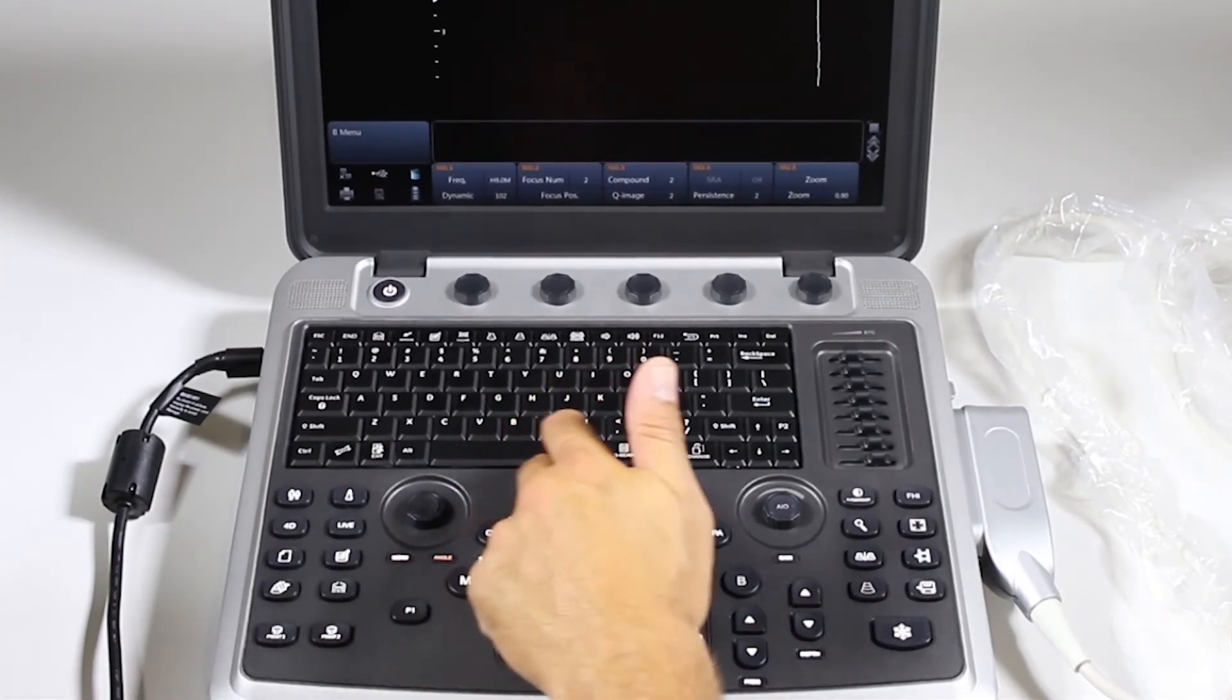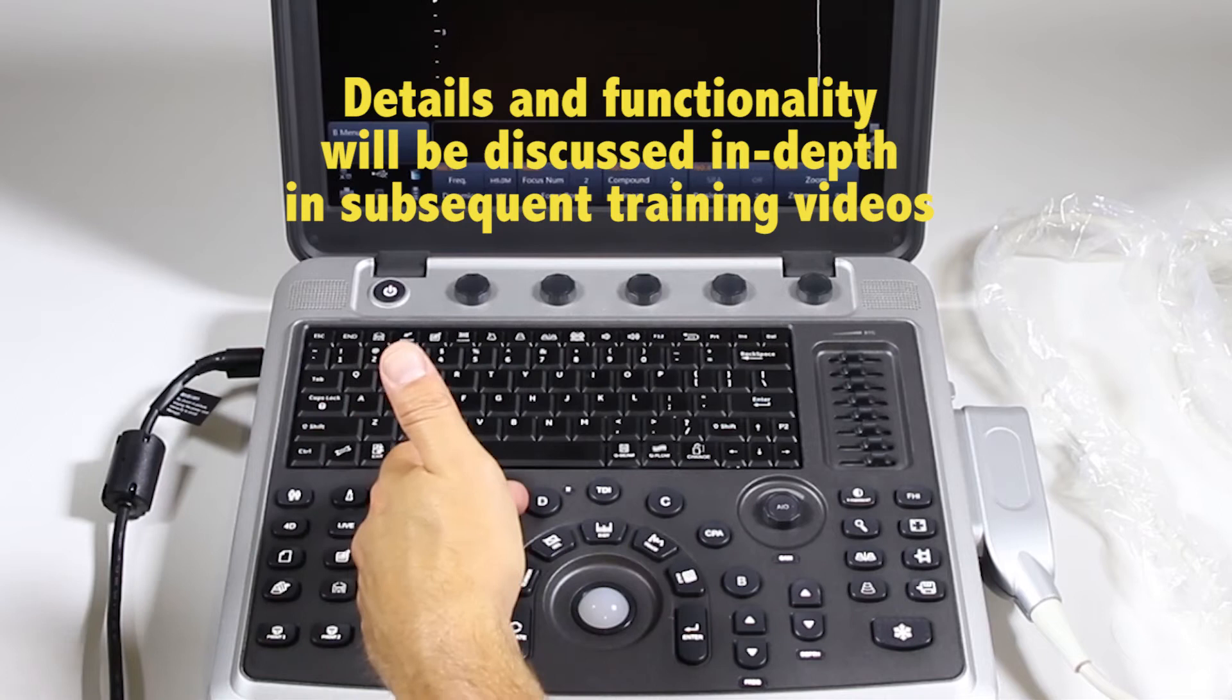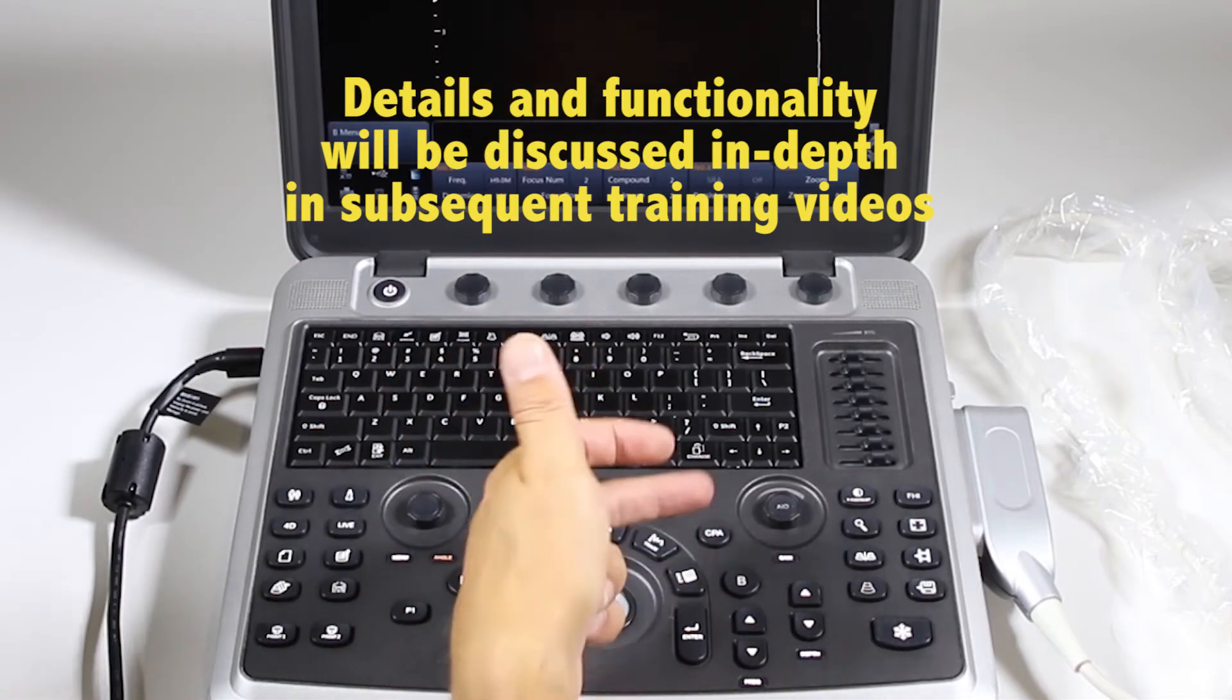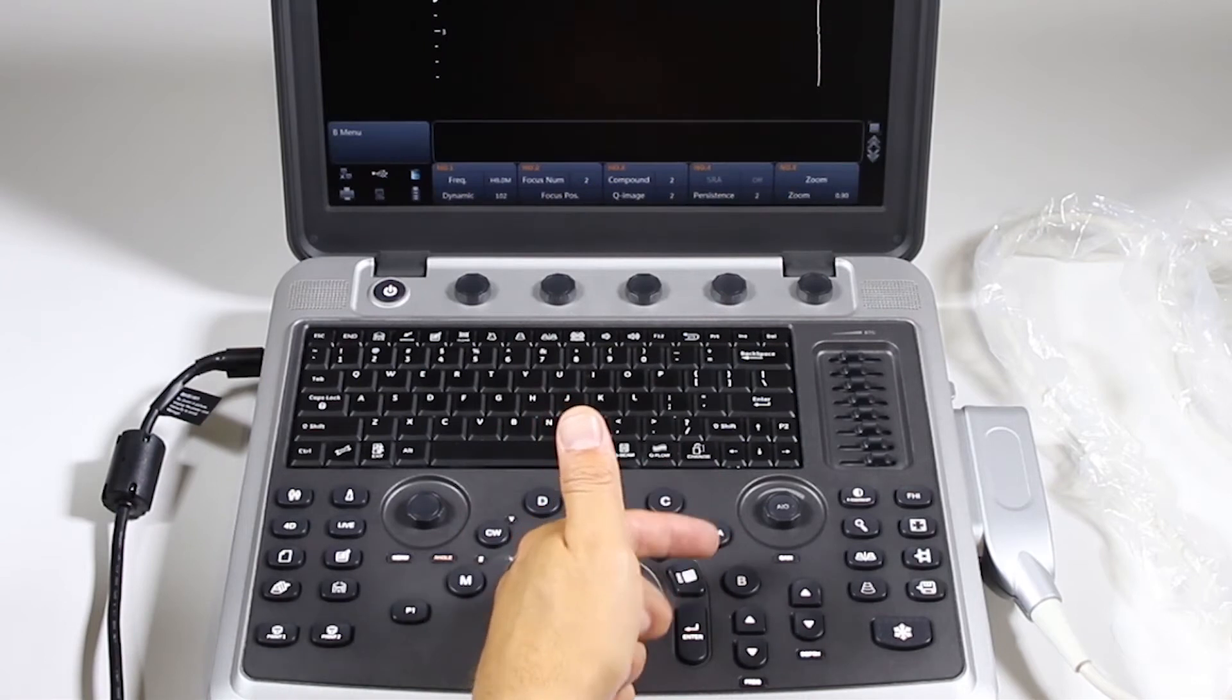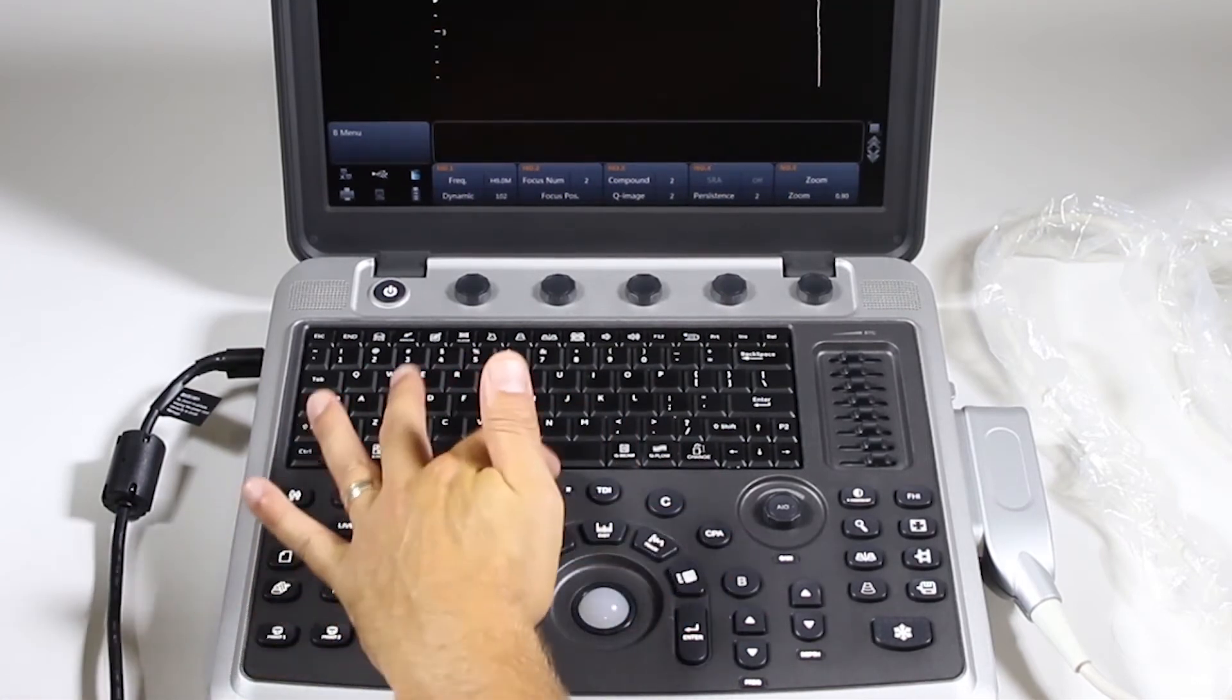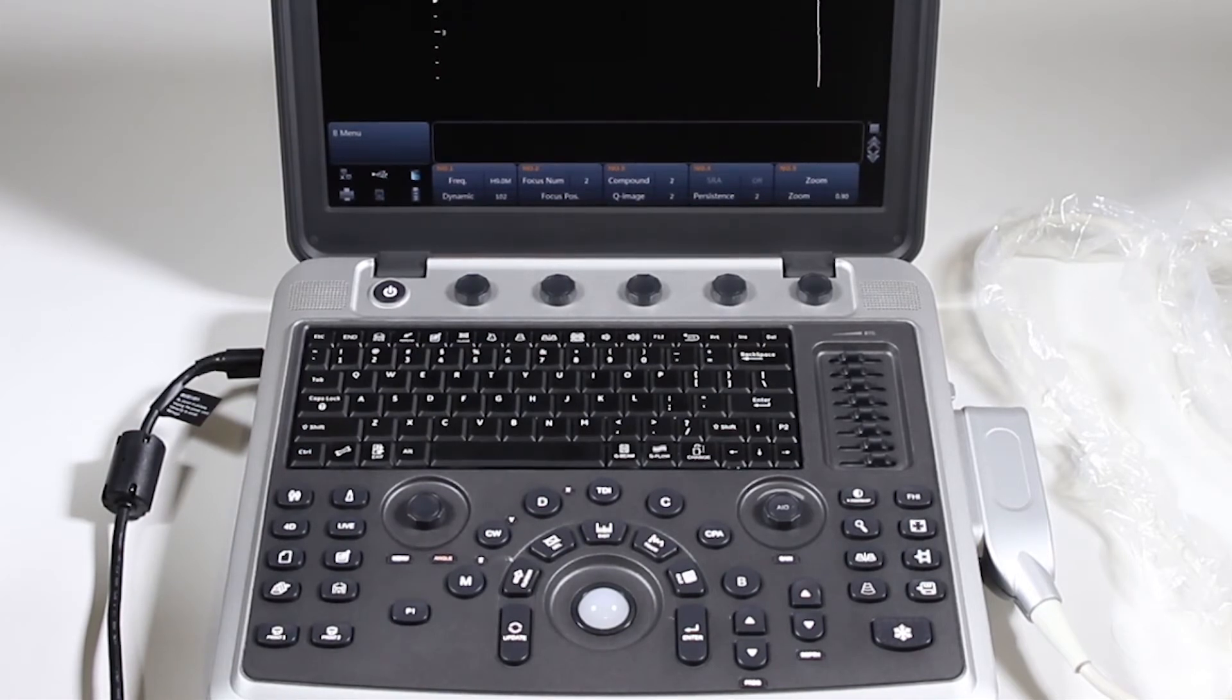Imaging modes all the way around here. M mode, CW, Doppler, Pulse Wave Doppler, Tissue Doppler, Color, Color Power Angio, also known as Power Doppler, and B mode, also known as 2D. This Z, Y, and X, those are strictly for 4D imaging. They don't apply in any other mode.